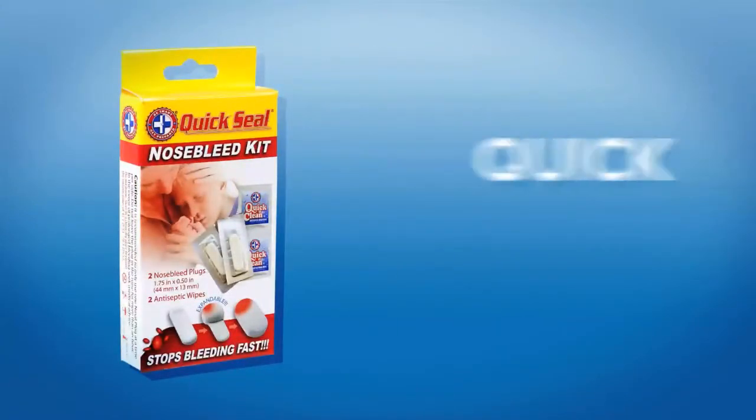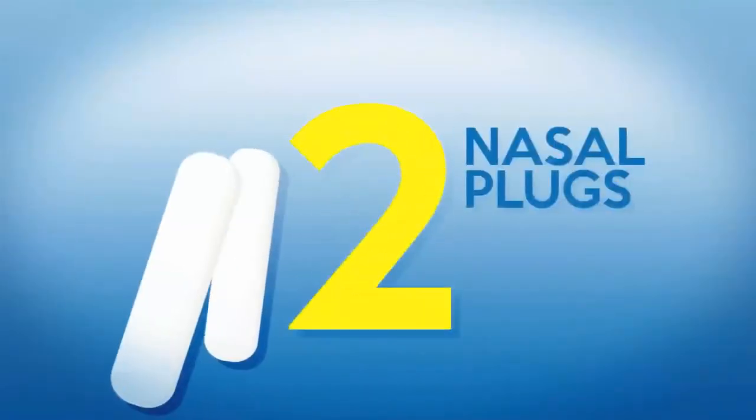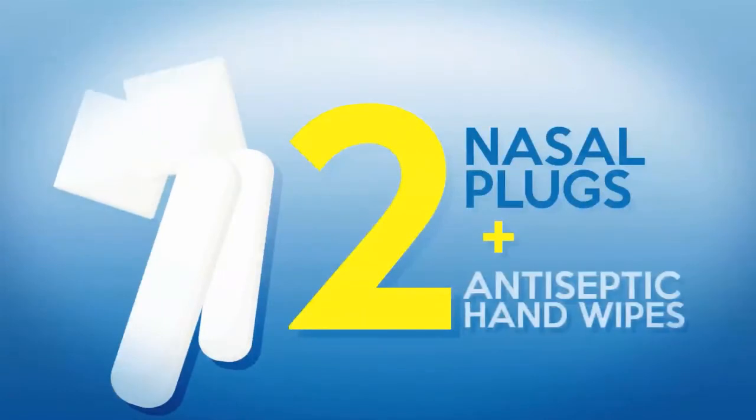QuickSeal Nosebleed Kit offers a quick, convenient, and reliable solution for nosebleeds. It comes with two nasal plugs and two antiseptic hand wipes for easy cleanup.